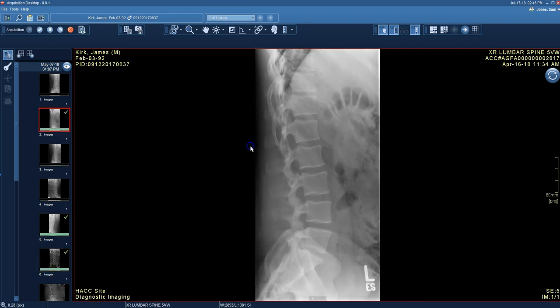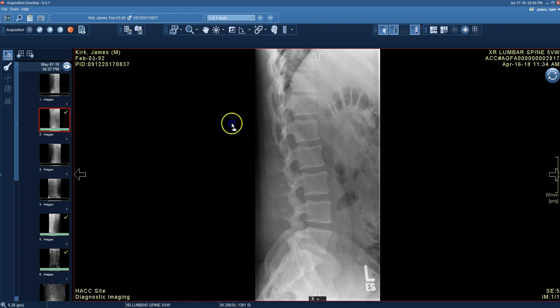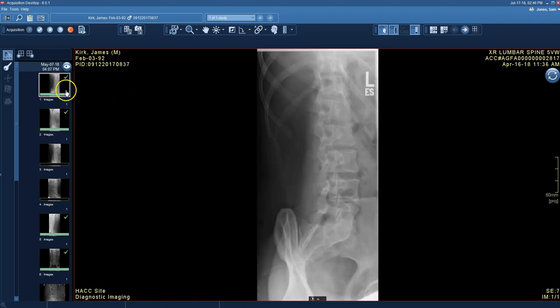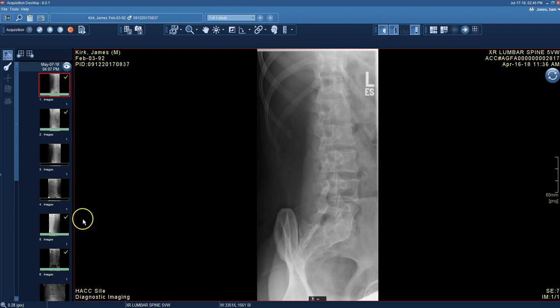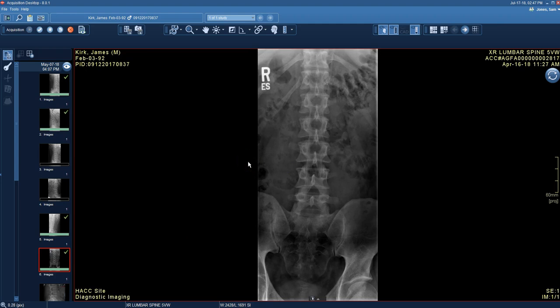Double-clicking goes back to the four-up window; double-clicking again goes one-up. To bring other images over, I just left-click, drag, and drop — there's the lateral view. Once I've moved it over it gets the full green bar and check mark, letting me know I've looked at it. It's a nice visual reminder so you don't miss any images when reviewing a study.